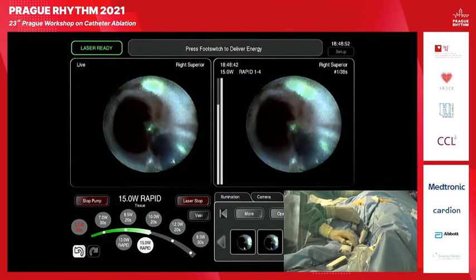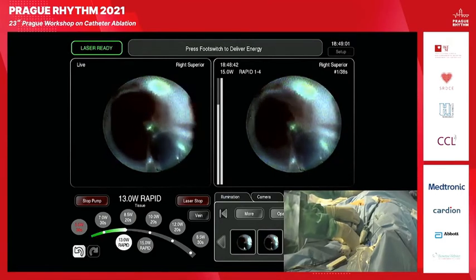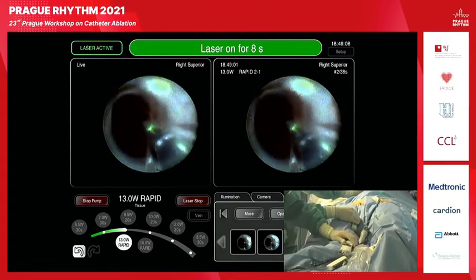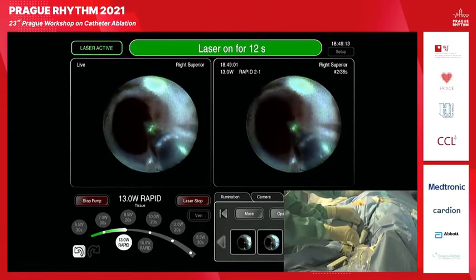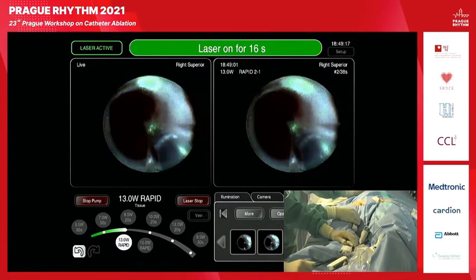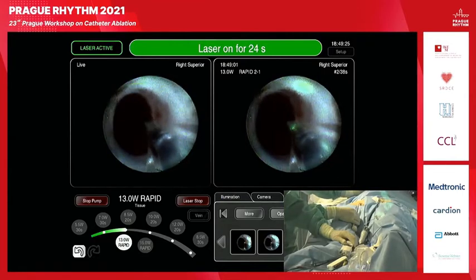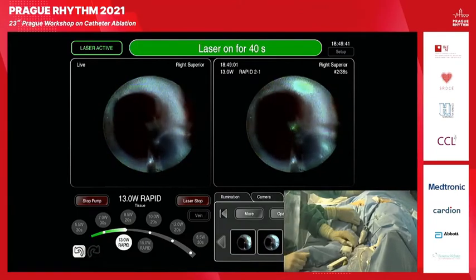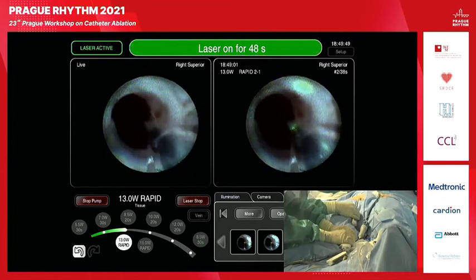Okay, so now we can change to 13 because I really don't want to burn too much. And what I would like to say is, when I interrupt, I'm always going a little bit backward to get the continuity of the lesion. A very big advantage of this system is that the so-called rapid mode really allows you to take all the circumference of the vein. What I need to say is we have chosen for you, for the live case, the worst vein in this patient, because all other veins were much better in terms of contact. So I really want to show you the ability to rotate and to treat all the veins regardless of the anatomy.